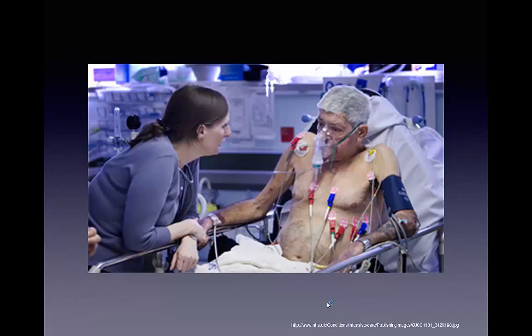For induction, we're going to use rapid sequence induction. He is going to receive 50 microgram push of fentanyl after airway topicalization, followed by propofol, 20 milligrams, followed by rocuronium 100 milligrams. At this point, he will be laid flat, a few ventilated breaths will be delivered, and then we will proceed with laryngoscopy.